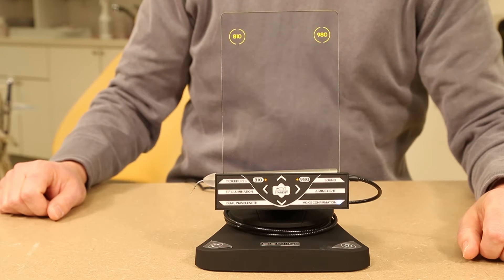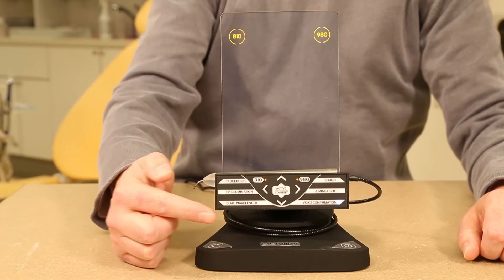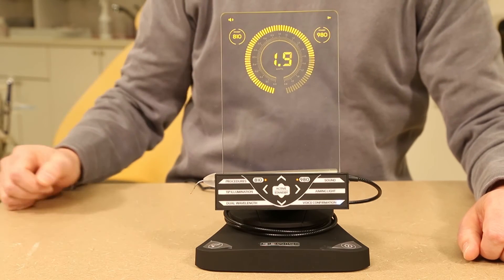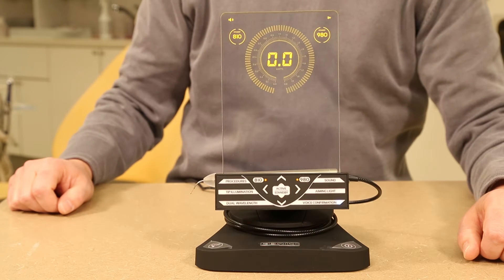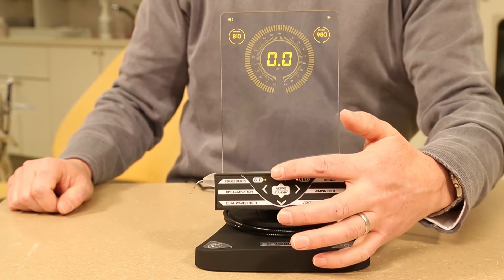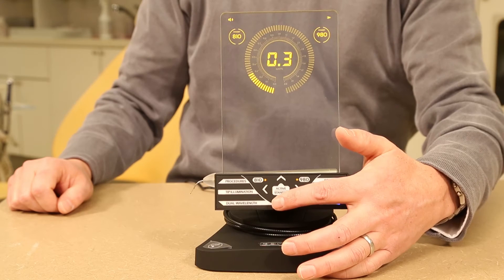Next you will select the desired wavelength: 810, 980, or dual. You can then adjust your power setting manually or select your procedure from the list of preset procedures.